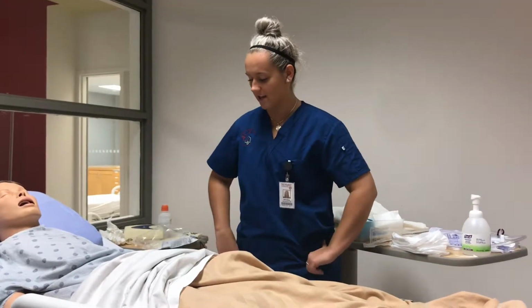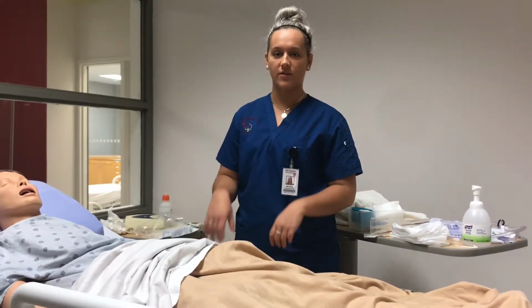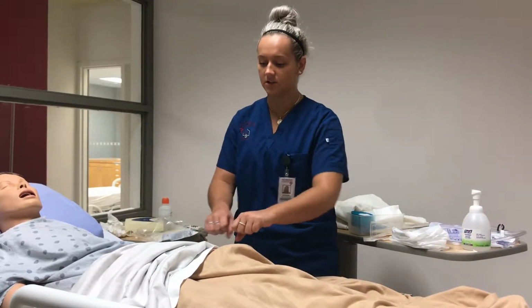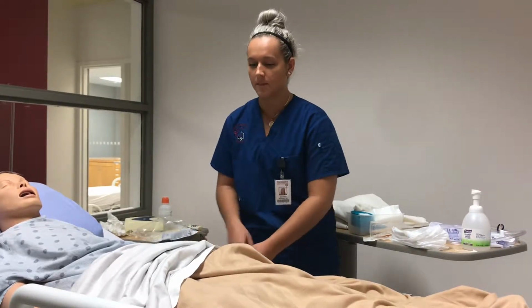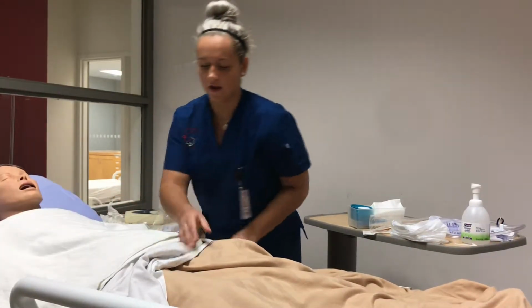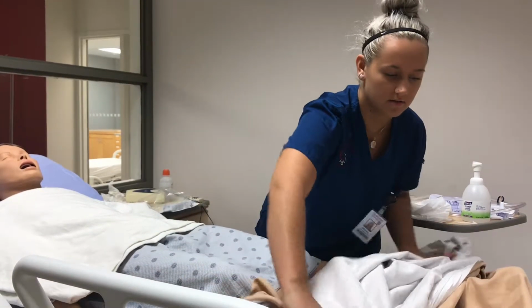Okay, so before I begin, I'm gonna wanna make sure that the bed is at about the height of my hips so that I'm not leaning over very low, and I'm gonna wanna make sure that I can easily insert at a comfortable level, and I'm gonna wanna make sure that the patient is comfortable. So I'm gonna start by putting the drape over here, and then I'm gonna pull down the blanket.